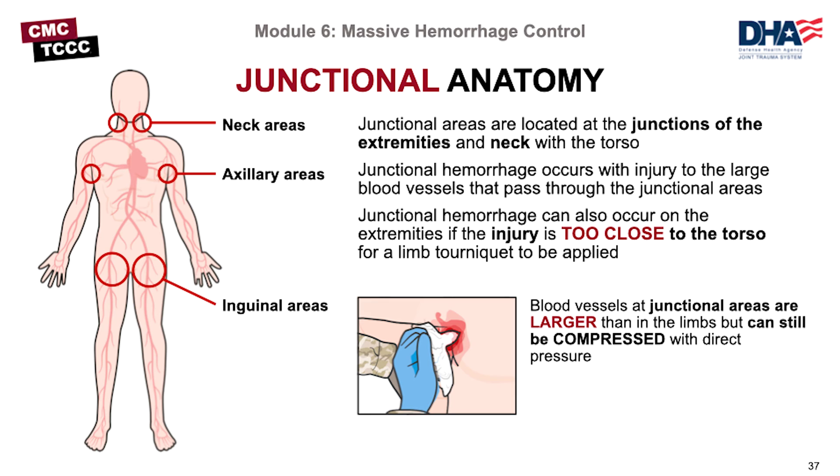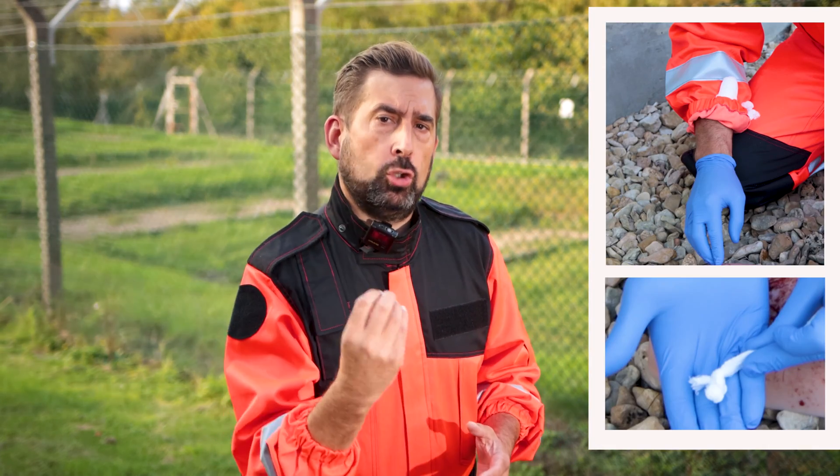First, remember that due to its nature, wound packing is most effective in so-called junctional areas like the groin, armpits, or neck. Packing the torso would be counterproductive as you could not achieve digital pressure. Now, make sure that your hemostatic dressing is easily accessible with one hand. Army medics I spoke to advise opening the packaging and having it ready in your sleeve or behind your gloves, preferably with a small knot on the end.